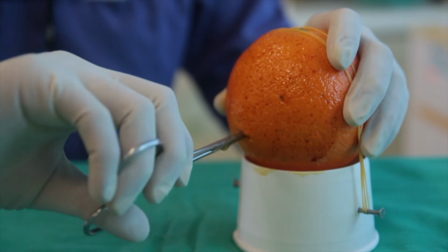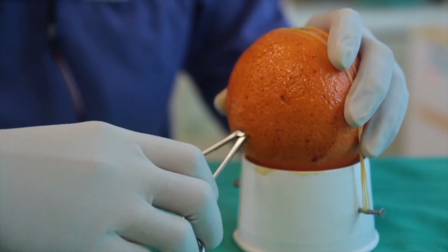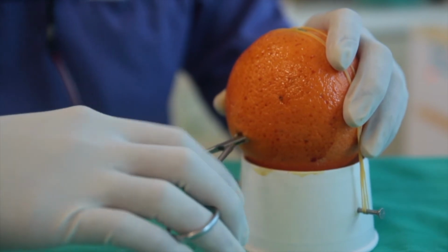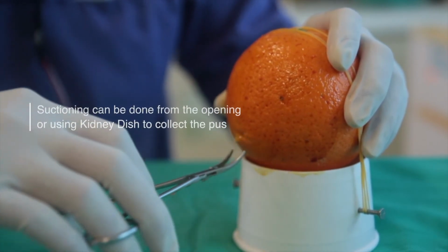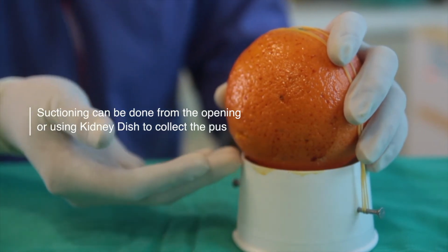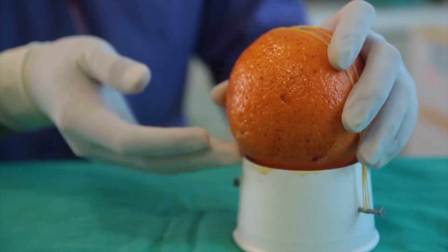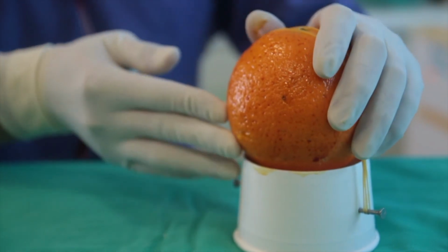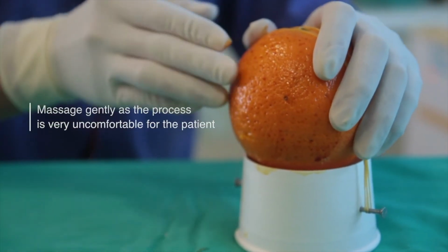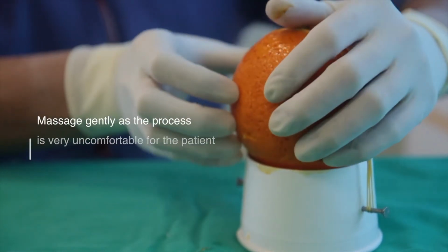You can do some massaging around the swelling area to make sure all the pus will come out. The role of the assistant at this point is to do suctioning at the opening or use the dish to collect the pus. So you need to be very gentle. At this moment, it's going to be very uncomfortable for the patient.